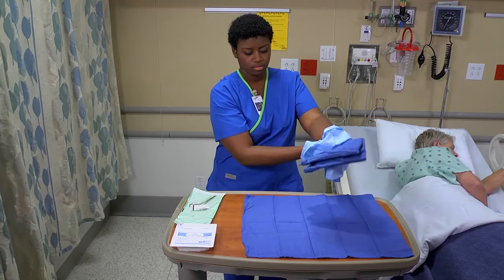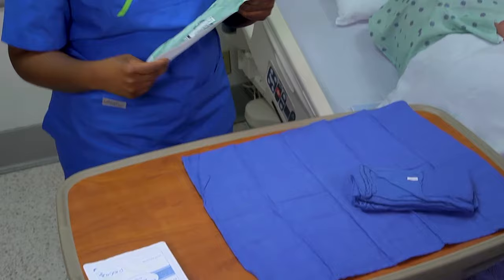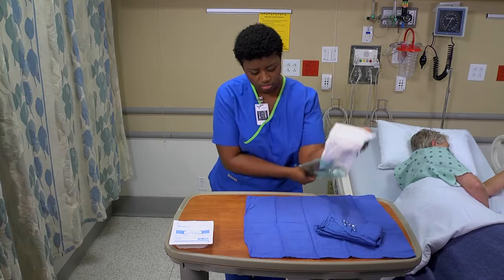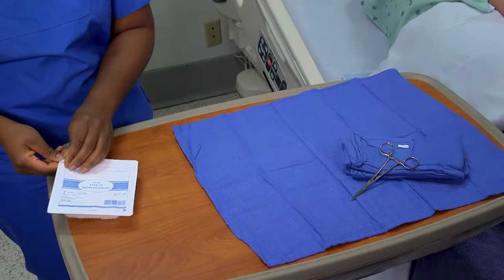Be sure to hold the outer wrapper of the package in your non-dominant hand. Carefully peel the wrapper down over your non-dominant hand. Place the sterile item onto the field at an angle, taking care not to let the wrapper fall down and contaminate the field.